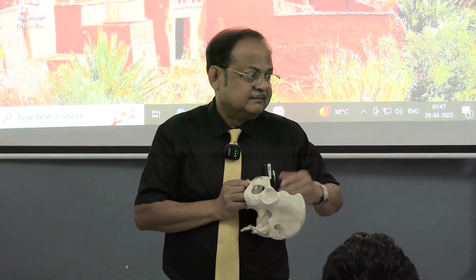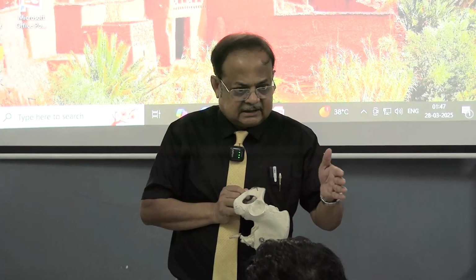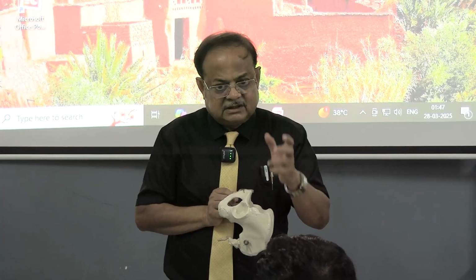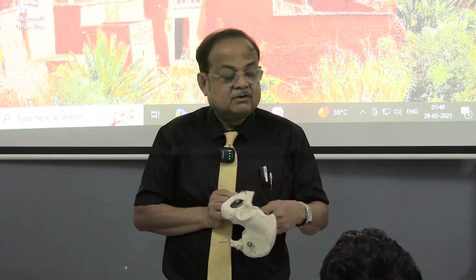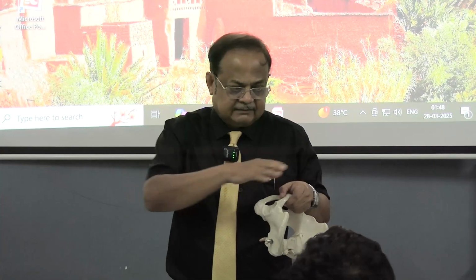And there should be no pelvic contraction, and the head is engaged and low down. If the head is high up, you cannot give it. Contraindication: you cannot give it in a non-dilated cervix. You cannot give it if the head is high up, not engaged, or if there is pelvic contraction. I am coming to the prerequisites, you are asking about the prerequisites. So these are the contraindications.